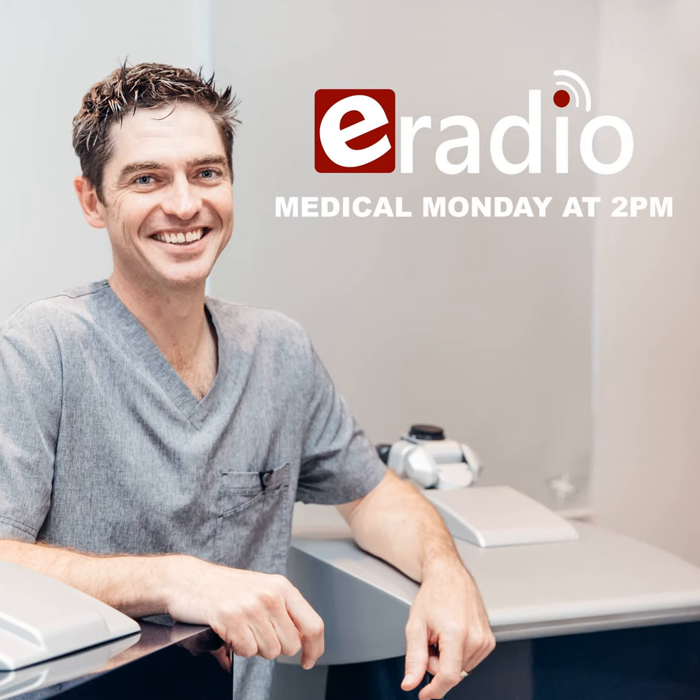One of the predecessors of laser to correct something called short-sightedness or myopia was a procedure called RK, radial keratotomy. I'm not sure if you've heard of that, but it was done on thousands and thousands of people in the 70s and 80s, and it worked very well. But the problem is it actually changes the shape of the cornea quite significantly, and it can change the optical quality, and some of them were left with scars.